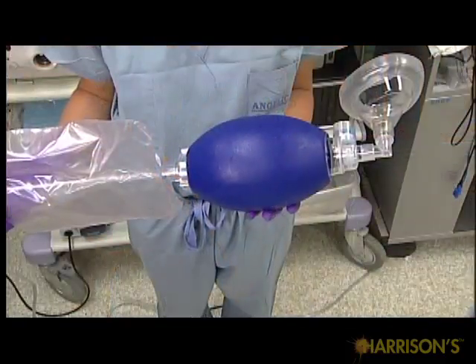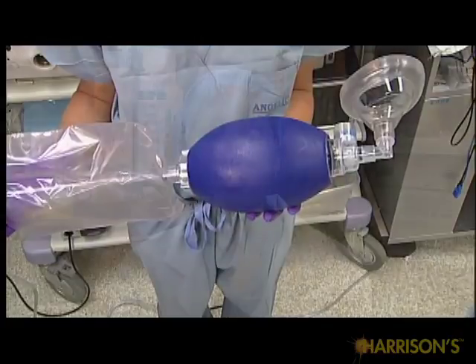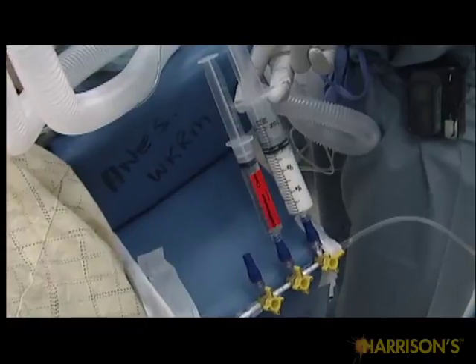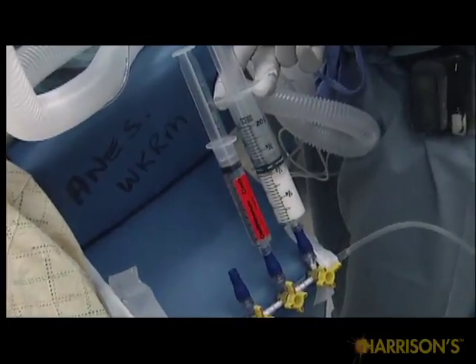Prior to attempting endotracheal intubation, any practitioner should be adept at mask ventilation, the most important airway management skill. If you can successfully mask ventilate a patient, then you can maintain ventilation and oxygenation until a more experienced airway provider is available to perform endotracheal intubation. If your patient is conscious, you need to administer an induction agent before attempting mask ventilation and intubation.